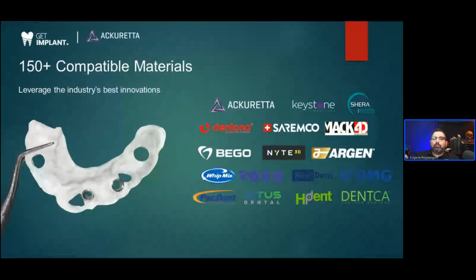I currently don't print any permanent dentures. Most of the dentures that I print are temporary ones. So either I print it with a pink and a white, or, if it's a short-term temp, I'll use GC temp resin and do it in white and do a cutback with Gradia composite. So you have your choices here. You don't have to be stuck with every single one. And it's an open system.